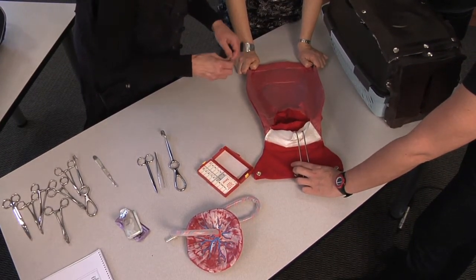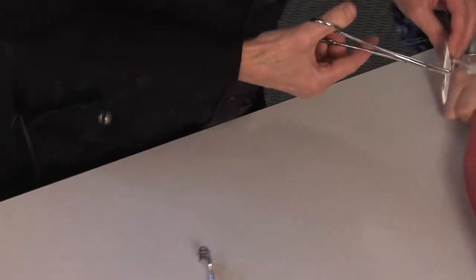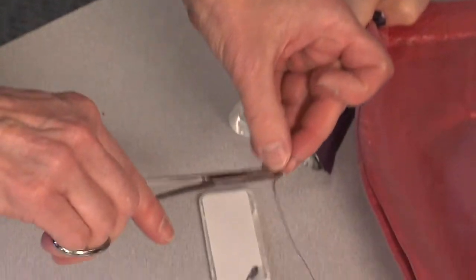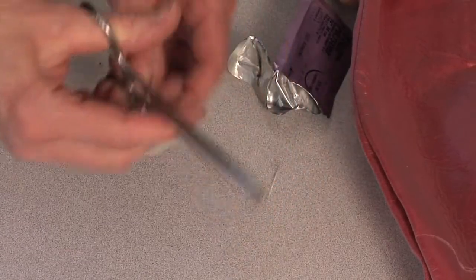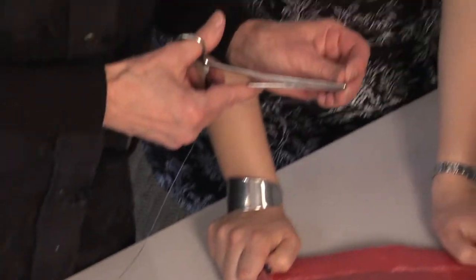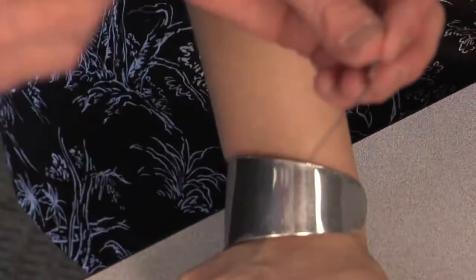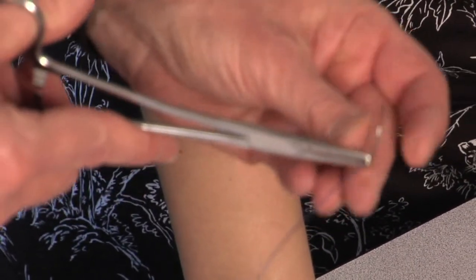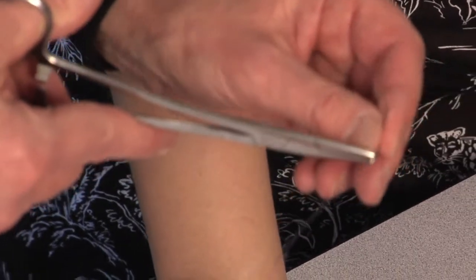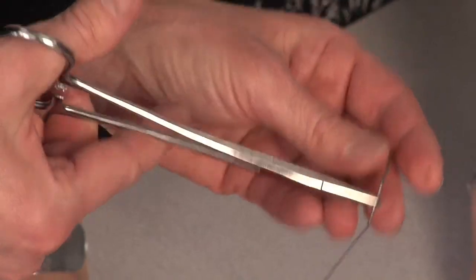One thing we practice with students is needle management. I'll give you a demonstration. I'm holding the needle with my fingers — we try not to use the fingers, but we show them where to put the needle driver on the needle. It's called a needle driver or needle holder. You don't want to put it too close to the end because it'll fall off, but you don't want to put it right in the middle either because it'll get in the way when you're sewing.